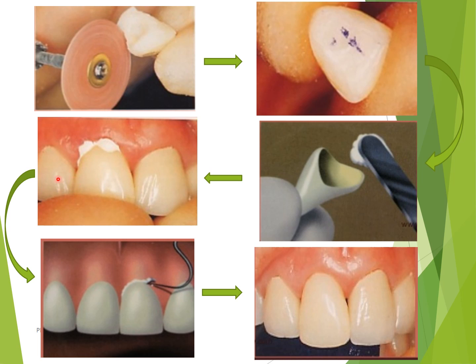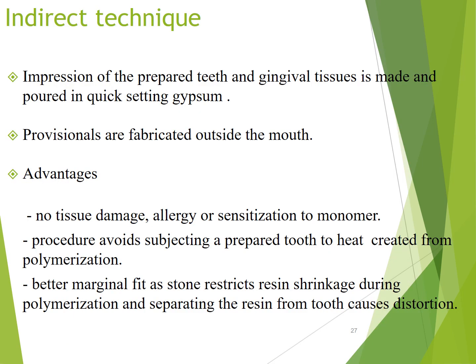Place it in the patient's mouth. Take out the excess by the margins and place it back in the patient's mouth. And check for the occlusion and the interproximal spaces and the clearance.